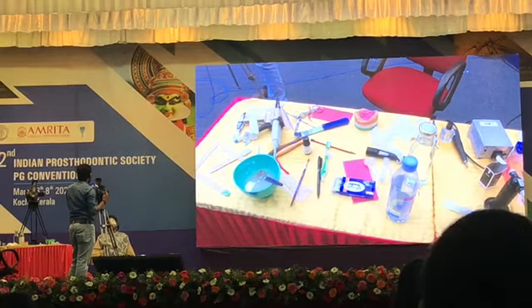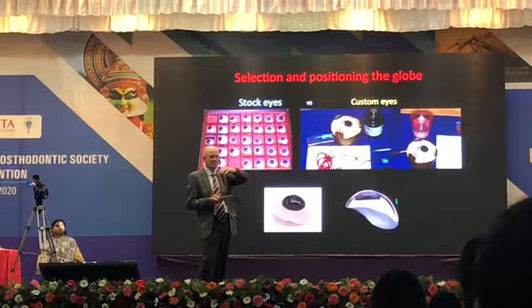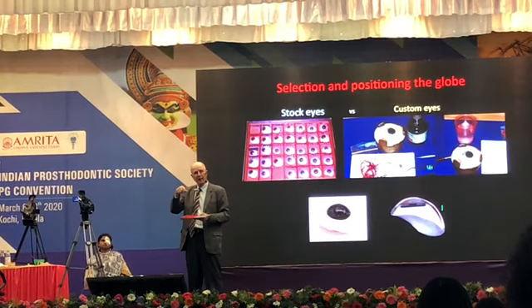Find it in the patient. And so you can't always use them. Sometimes you have to make them customized so you get the right spherical dimension. Because if the globe is too small, when you go to sculpt the orbital prosthesis and the lid contours, the scleral show, or the white of the eye that shows, will be too small.